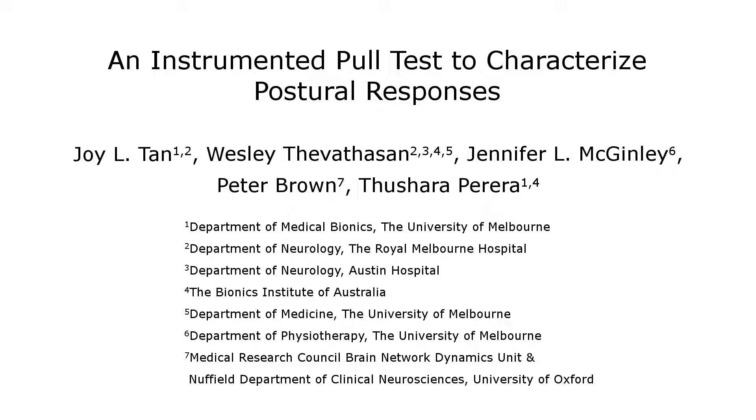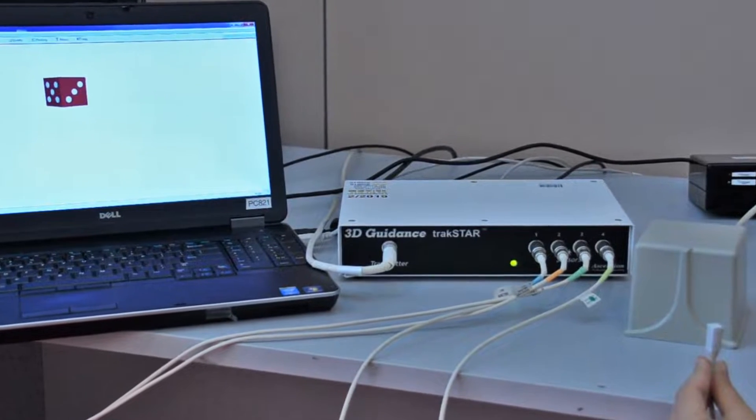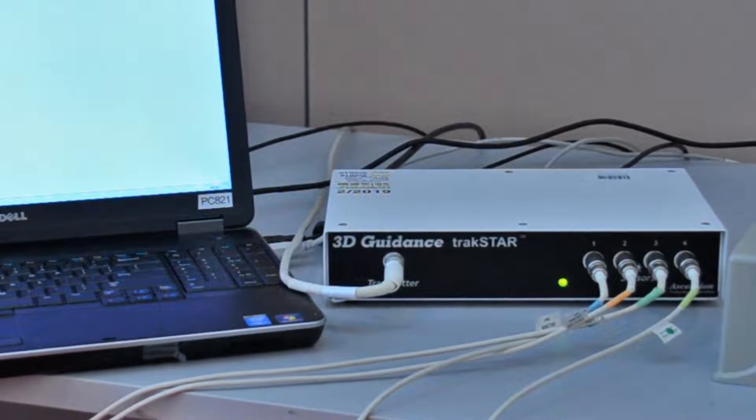The overall goal of this procedure is to assess postural responses more precisely using an instrumented version of the clinical pull test. This is achieved by using a semi-portable motion tracking system to capture postural responses to a manual backward pull.